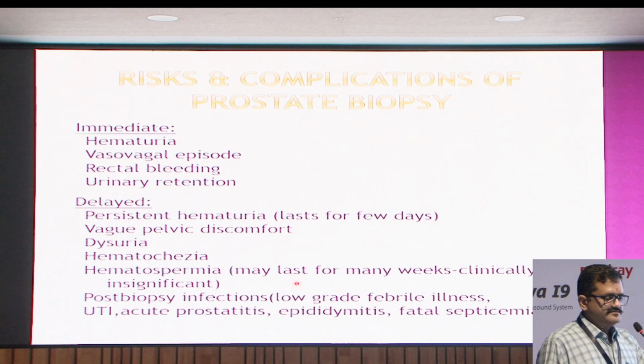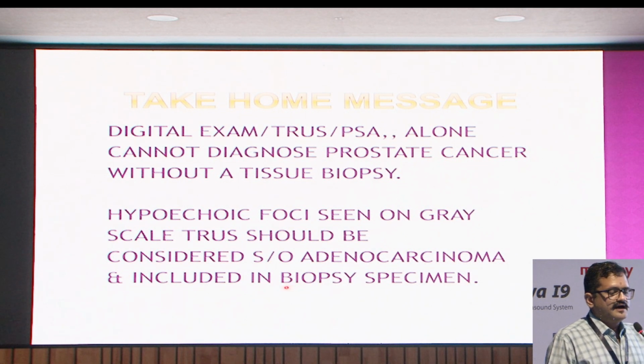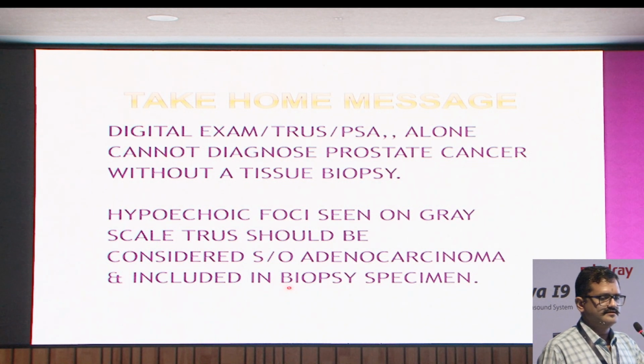So the take-home message is that digital examination, TRUS or PSA alone cannot diagnose prostate cancer without a tissue biopsy. Hypoechoic foci seen on grayscale TRUS should be considered as adenocarcinoma and included in the biopsy specimens.